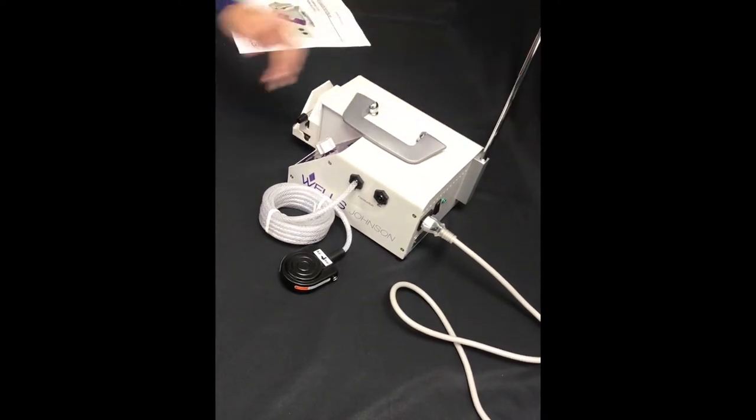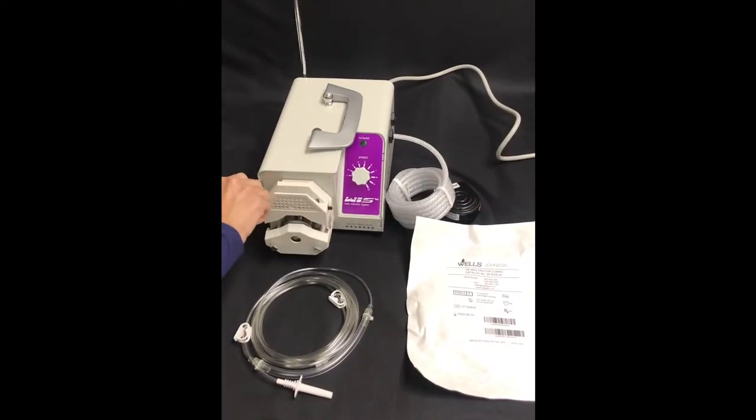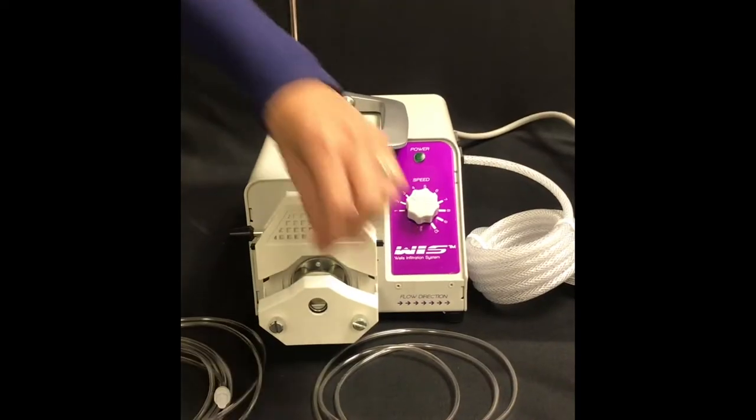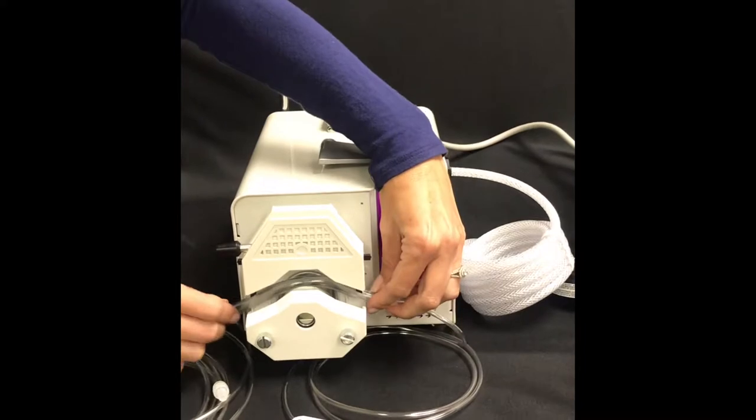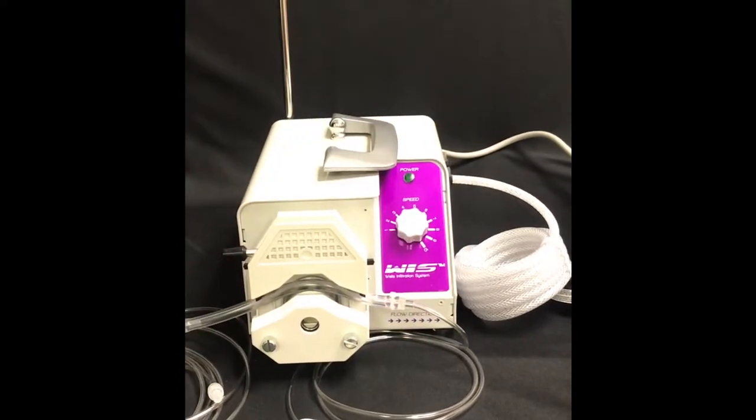Load the sterile infusion tubing by rotating the pump head lever counterclockwise to open the pump head. Insert the enlarged center section of the infusion tubing into the pump head opening over the rollers.